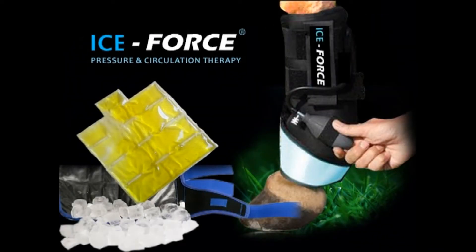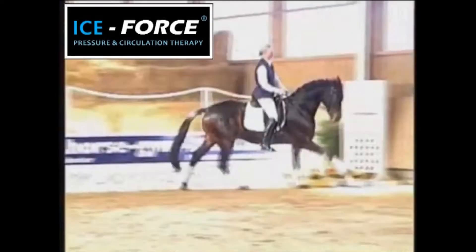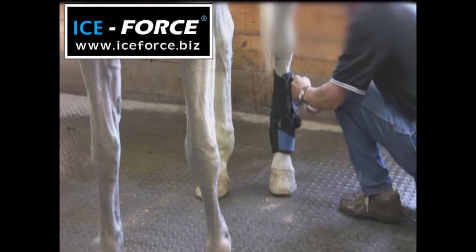Introducing the Ice Force Pressure and Circulating Hot or Cold Therapy System. Cold compression therapy has been widely used to prepare for competition. Now, the Ice Force Therapy System has raised the bar for cold therapy benefits.